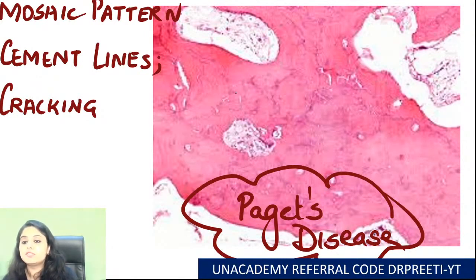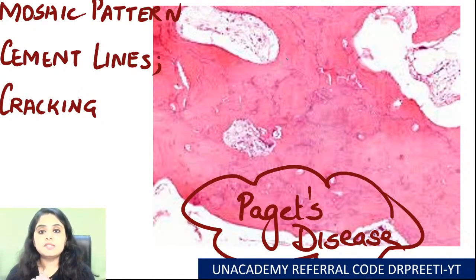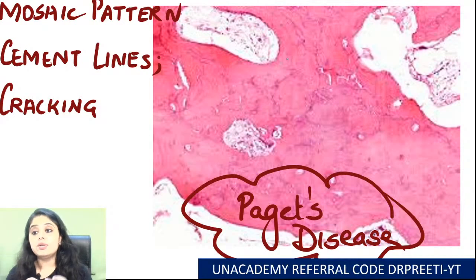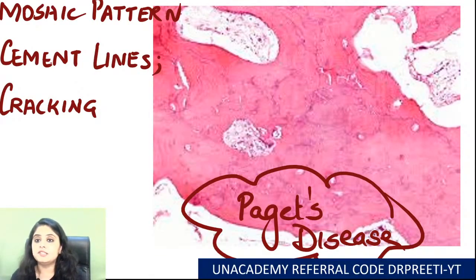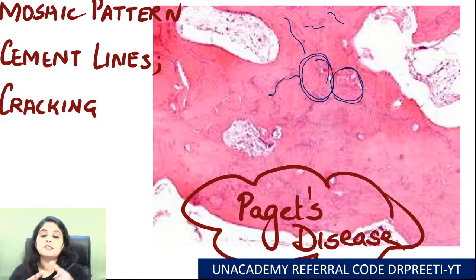What does Paget's disease show you? So if you remember, obviously this is not a theory session, but when Paget's disease starts off, it starts off as an osteolytic phase, where you'll see a lot of osteoclasts coming and breaking the bone. Then there is a lytic-blastic mixture phase. And then there is an osteosclerotic phase where you see multiple cement lines, you see these cracking artifacts, and those multiple cement lines give it that mosaic or jigsaw pattern.